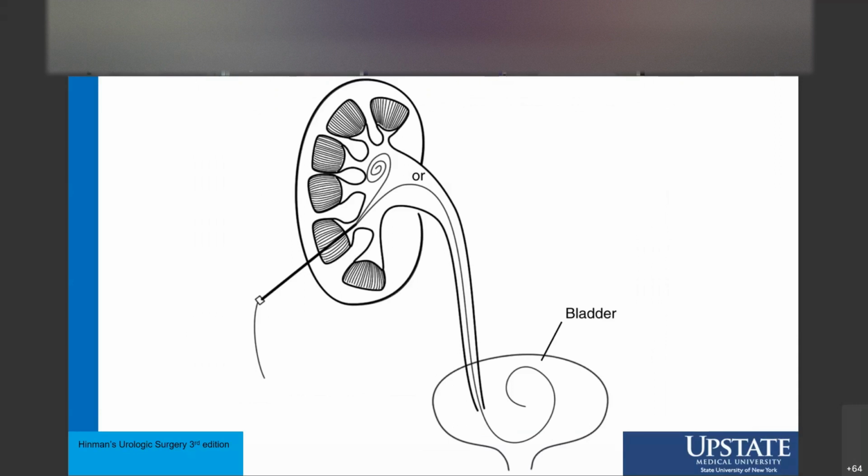So what we can use is a coaxial coiling wire. Coil that somewhere in the pelvis or the upper pole, get enough wire in the collecting system that you're comfortable that you're not going to immediately lose access. These wires are also PTFE coated, but not glide wires, so they stay nicely. If you can get a wire down the ureter, it's optional.